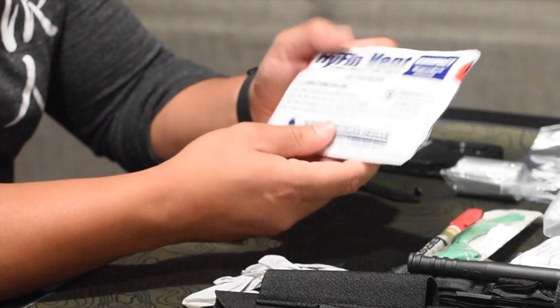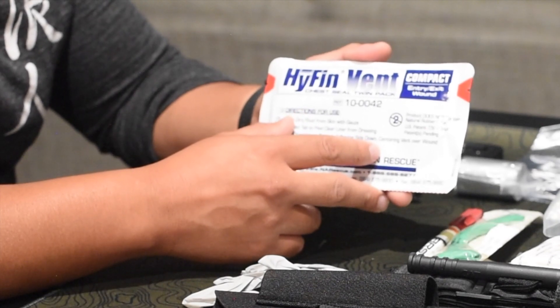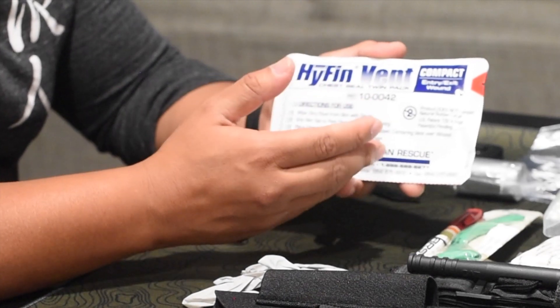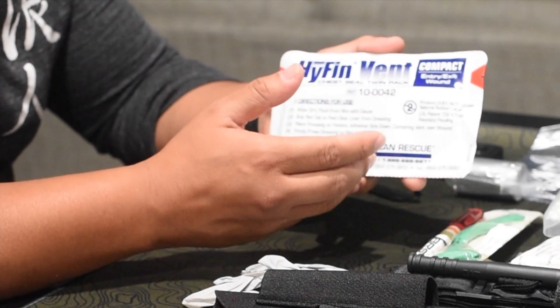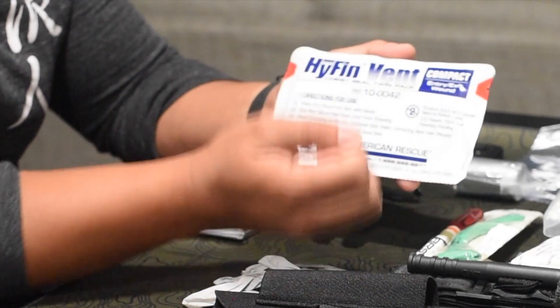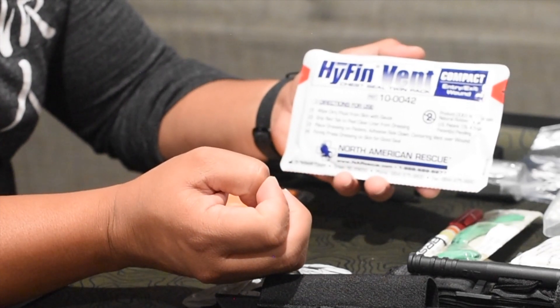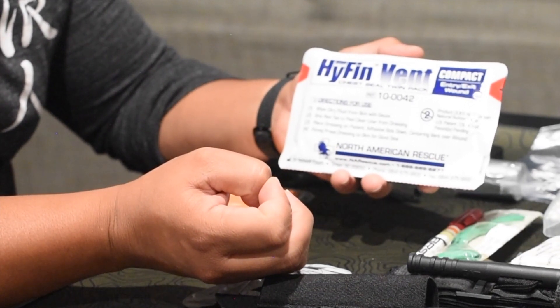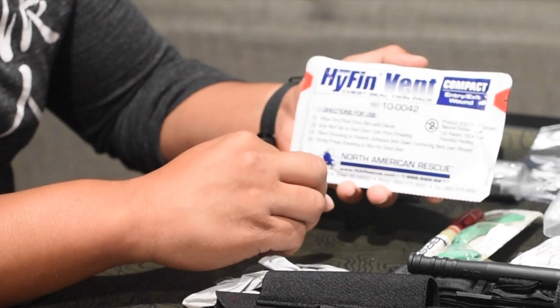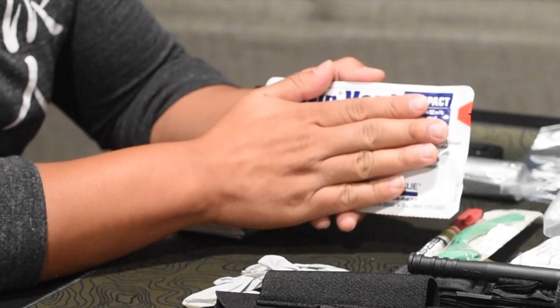The thing you have to note about chest seals on sucking chest wounds is you need to continuously monitor the patient. If they exhibit signs of difficulty breathing or symptoms are returning, you want to burp the chest seal — remove it for a split second, let the person breathe, let any excess air out. I would get my glove finger, stick it in, remove any clots or adhesions that could be blocking passage, and then put the seal back on.